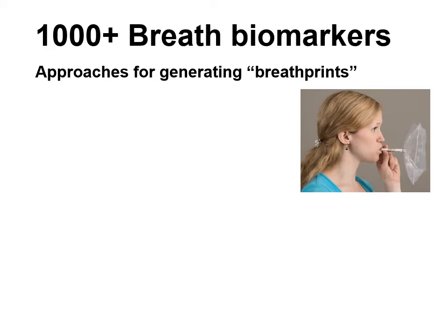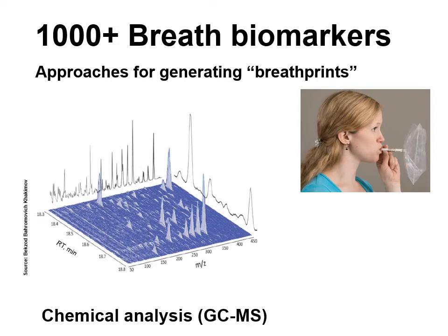One of those approaches involves taking a sample of the breath, as you're seeing this person doing here, breathing into that Tedlar bag, and then analyzing it on a sophisticated machine such as the analysis that I'm showing you here, which uses gas chromatography and mass spectrometry.